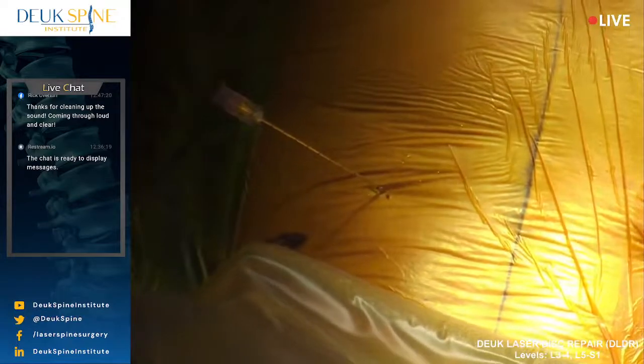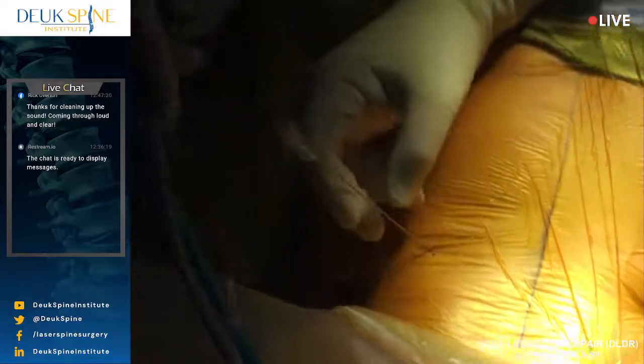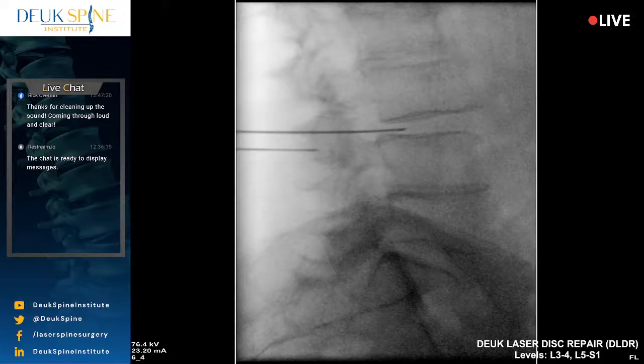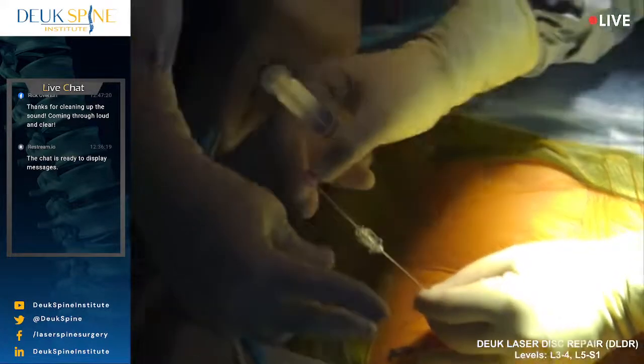You're doing great. Let me just get this done and we'll put you to sleep, okay? I want to be a little bit higher than I am. Let me give you some more numbing medicine. You're doing fantastic. Just give me a second. I'll give you some more medicine.